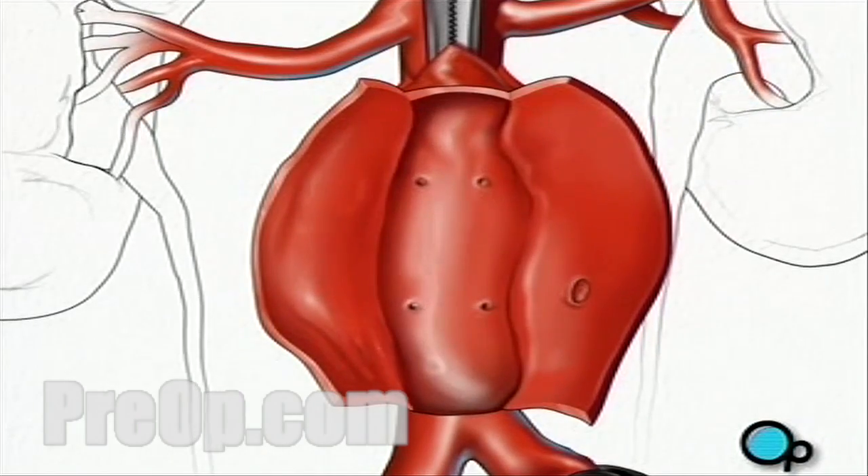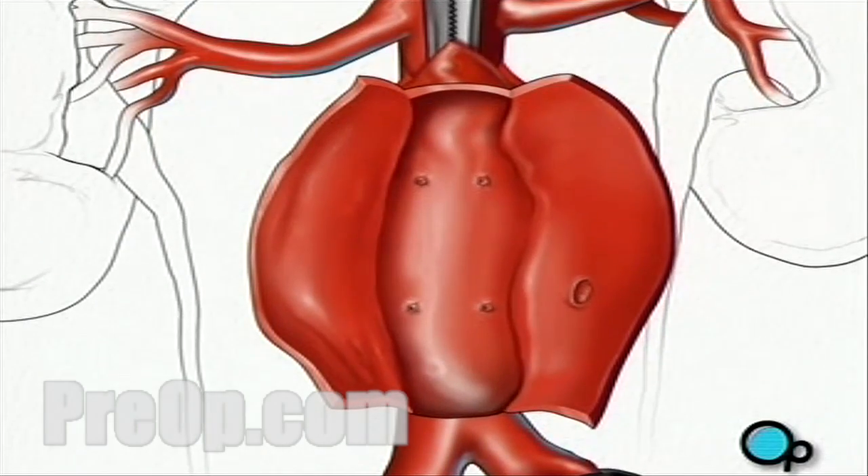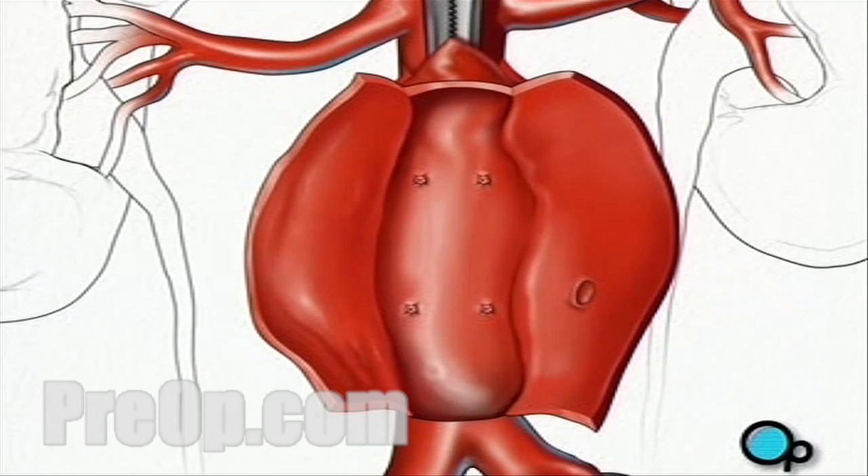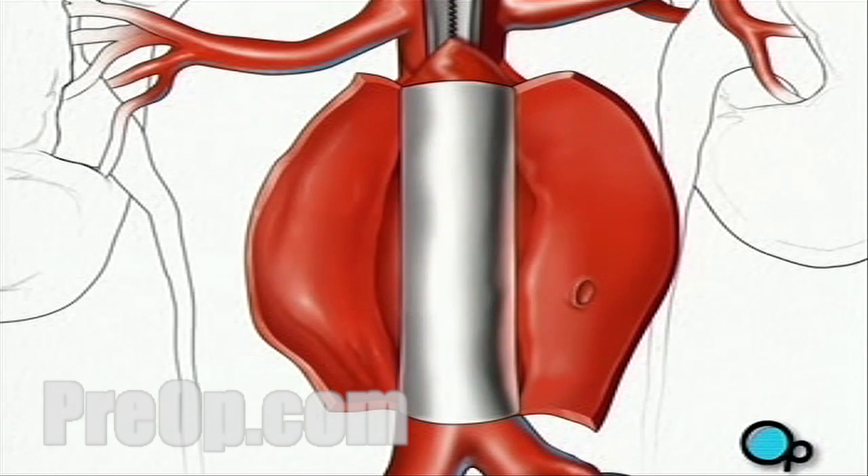The surgical team will sew together any damaged blood vessels inside the aorta. A tube made of a sterile synthetic material can now be inserted into the blood vessel to provide support and reinforcement. It is then sewn into place.